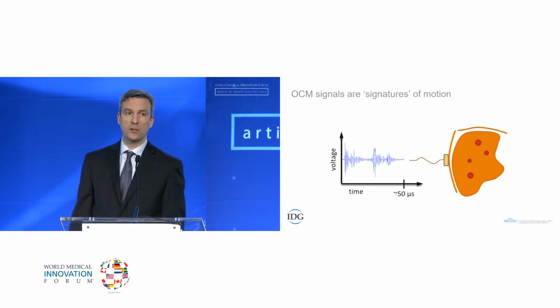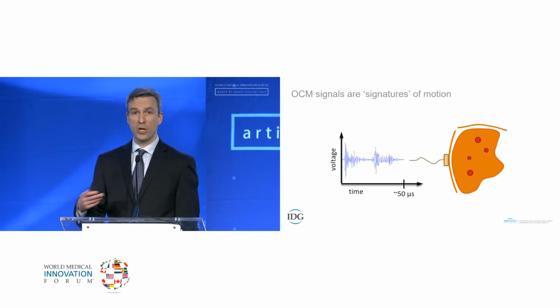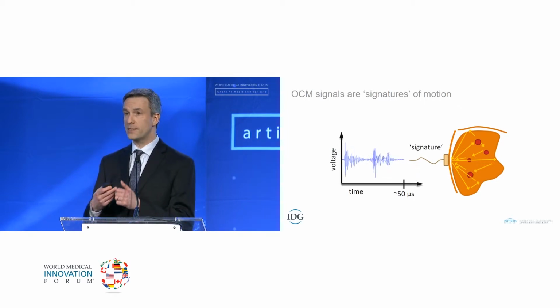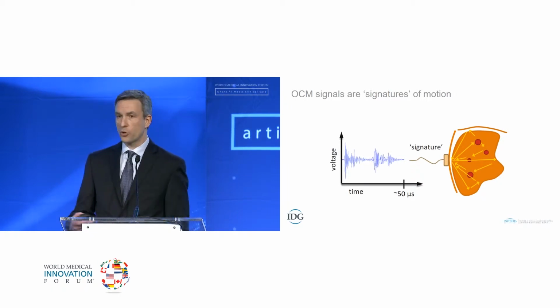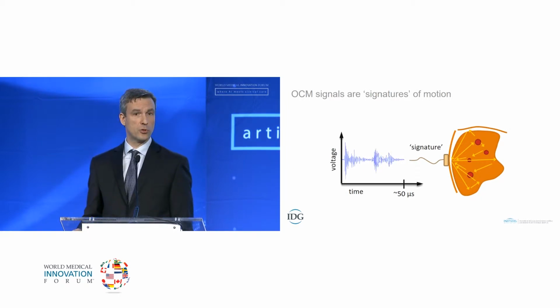It gives a signal which is exquisitely sensitive to internal motion. It generates an ultrasound field which is on purpose not focused. We embrace the fact that there might be multiple reflections. What we want is for the returning signal to act as a unique signature of the current configuration of organs inside the cavity. Our current prototype allows us to use up to 4 different sensors at a time, which can be placed at different locations on the torso for distributed sensing.